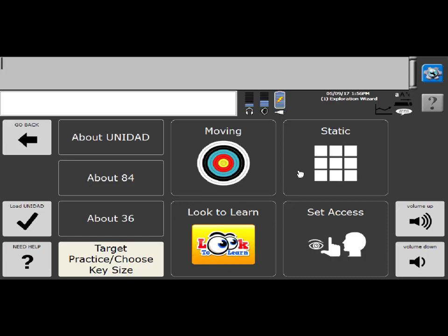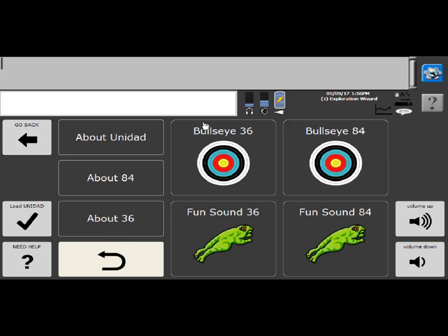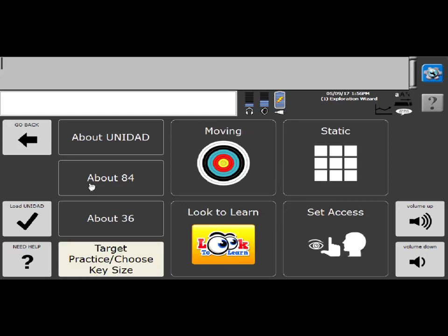And then, or static, so these do not jump around the screen. They're just static locations, bullseyes, and then some fun sounds with images. So you can use those to help you determine the best key size. Once you know that, you can load the program.